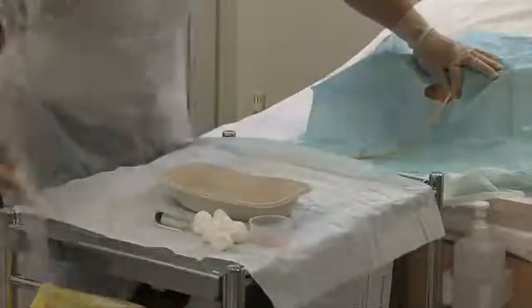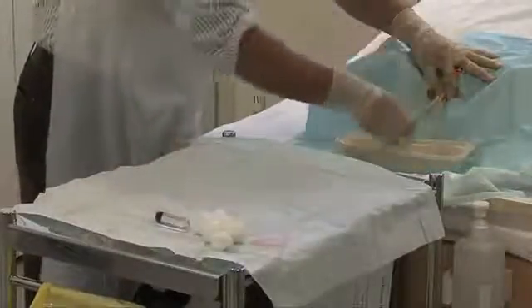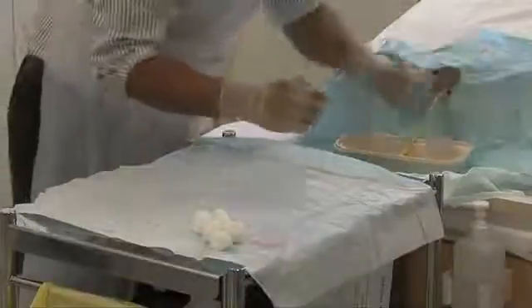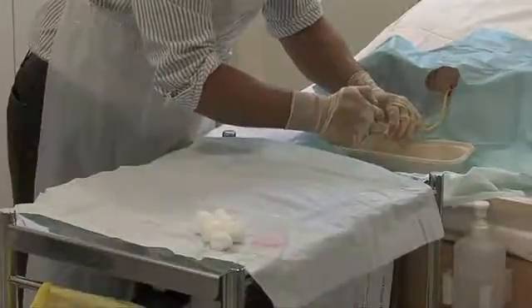Place a tray on the bed between the patient's thighs and place the distal end of the catheter in the tray. Slowly advance the catheter until 5 to 6 centimetres has been inserted. When urine begins to flow, advance the catheter a further 1 to 2 centimetres. Attach the syringe containing sterile water to the end of the catheter and inflate the balloon to secure the catheter in the bladder.